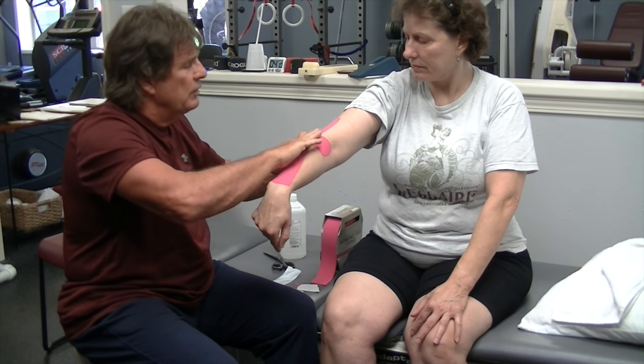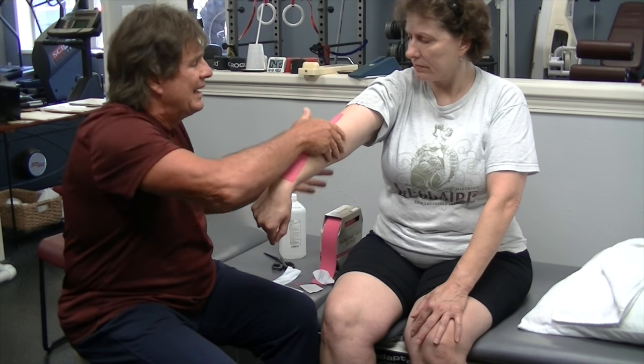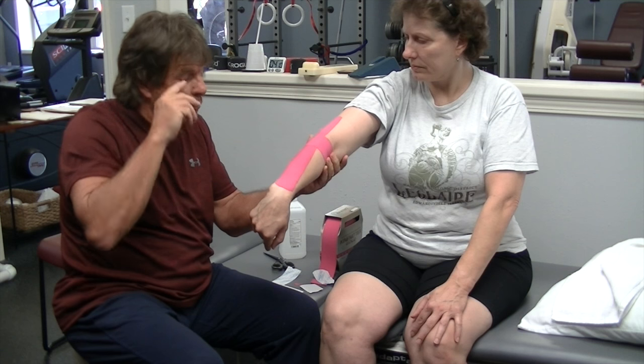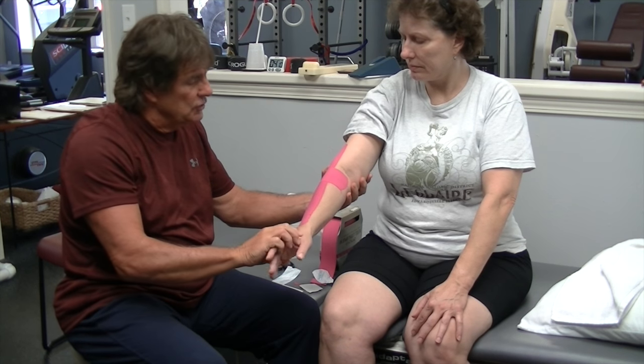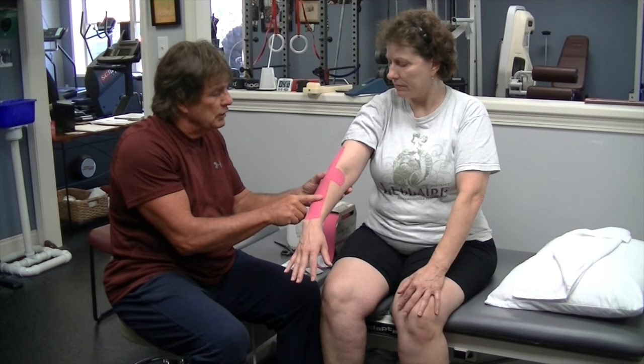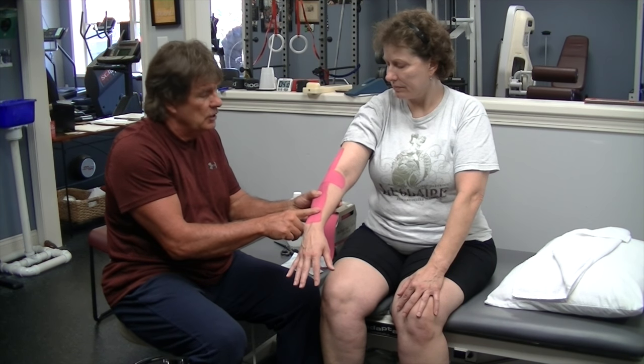I'll pull that over here and then just adhere that down and she's ready to go. Now what that did — when she relaxes — it causes a little bit of decompression in the tissues, which helps increase circulation and helps loosen up the tissues underneath.